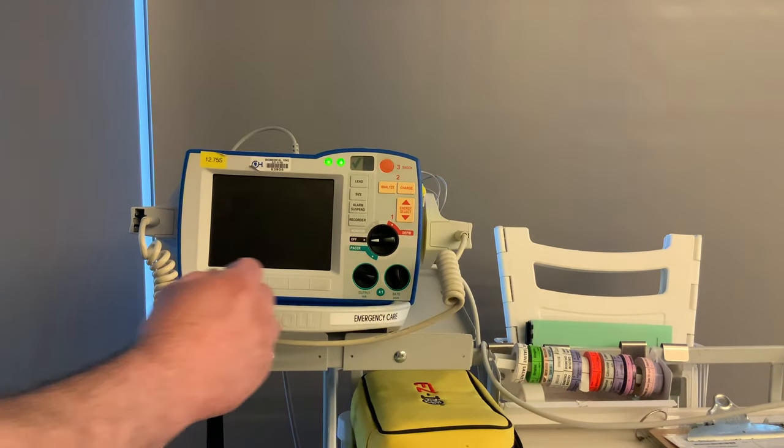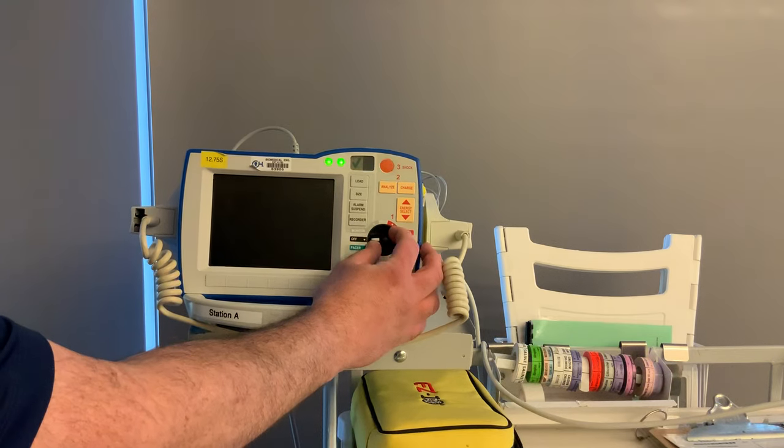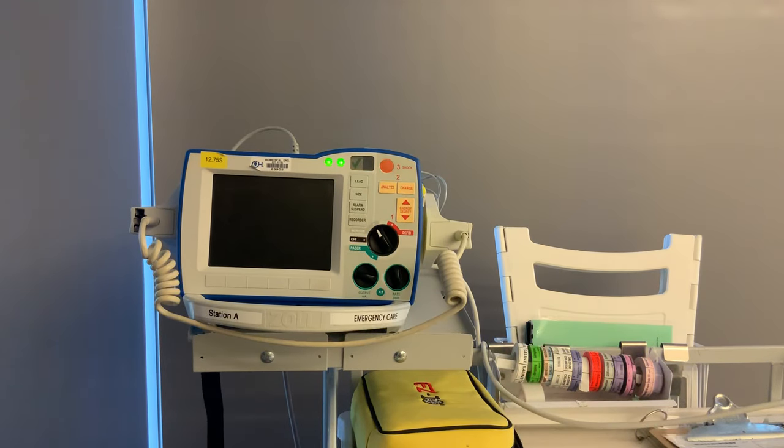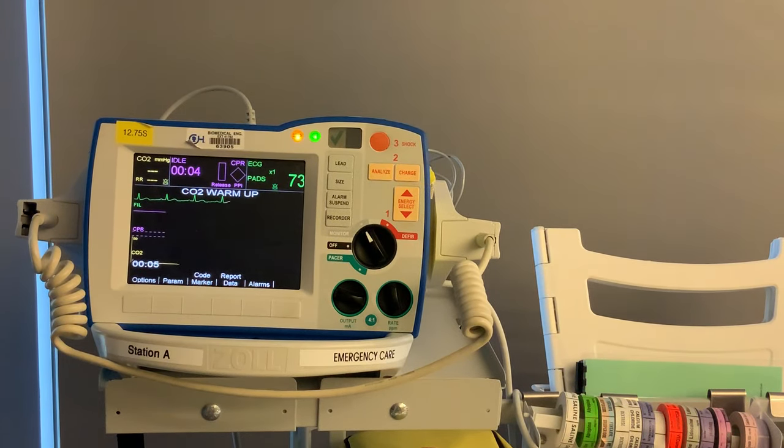Now that we have our pads connected, we're going to turn it on. There are two ways you can do this — you either turn it up to monitor mode or defib. Right now we're going to turn it to monitor mode. While you're in monitor mode, you can do all of your monitoring functions, but you can't do any therapy or treatment.